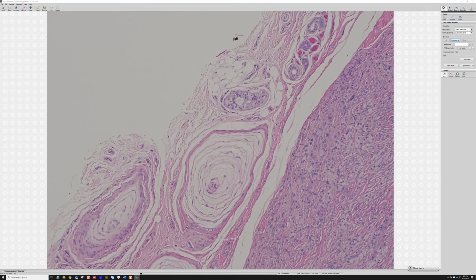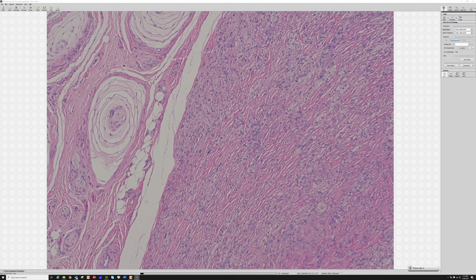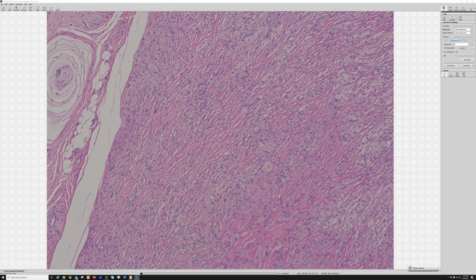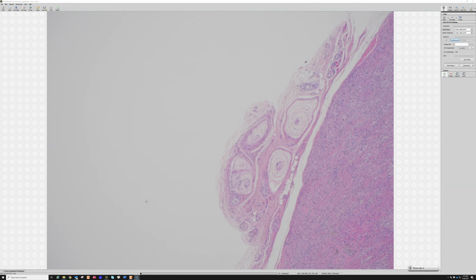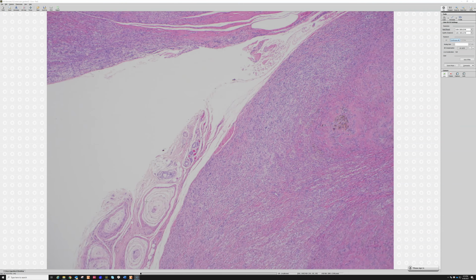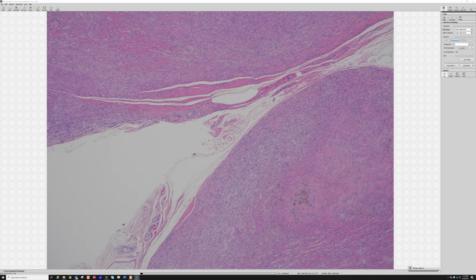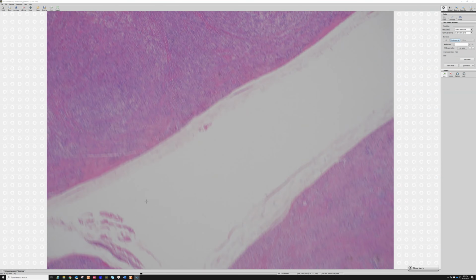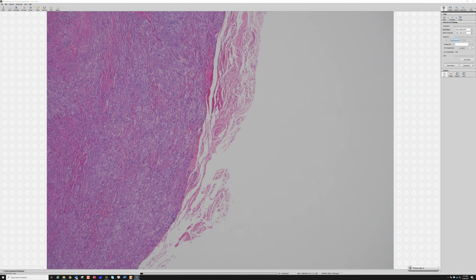So you'll see these skin structures like the eccrine coils, and then you'll also see a nodule that's maybe attached to the tendon sheath or something like that. So that's a good clue when you see Pacinian corpuscles to think of acral sites. When you see a nodule that looks like it's subcutis or even coming off of tendon or fascia, and it's got eccrine coils or eccrine sweat glands, whatever name you like, that's a good thing to think of the fact that you're probably coming from acral or a site nearby.